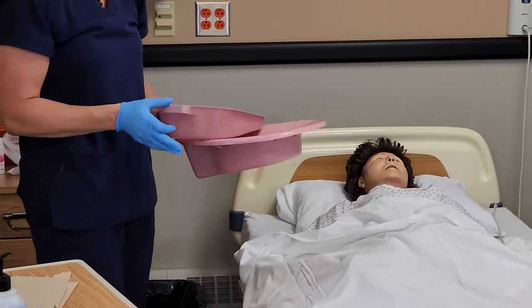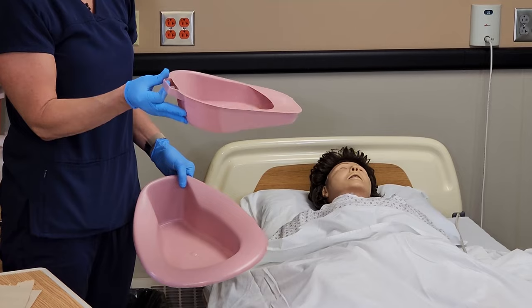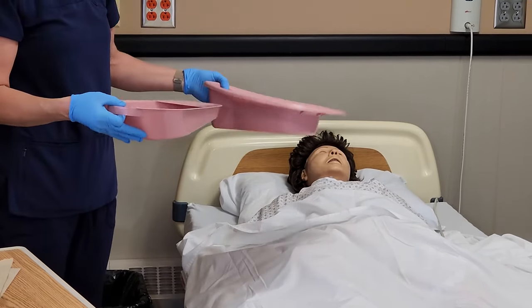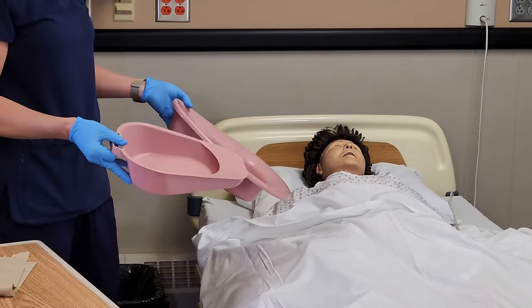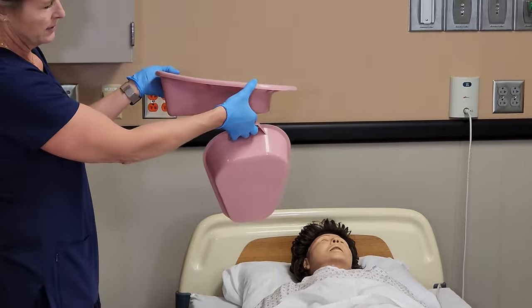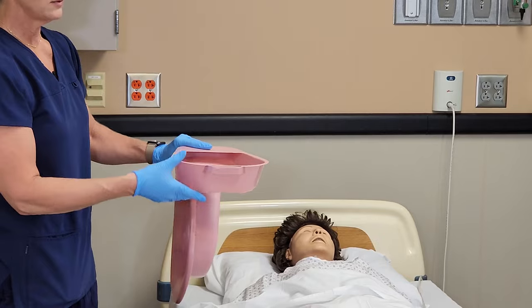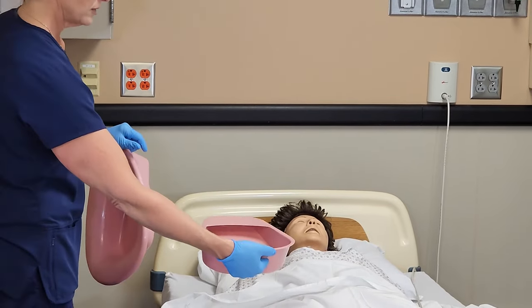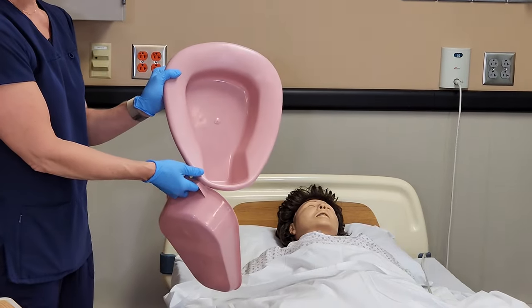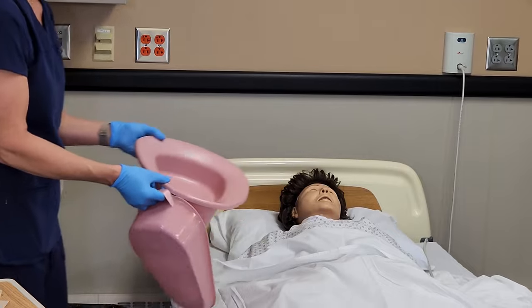We have both types here. A fracture pan is typically for people who have had a hip or leg fracture — it's a little bit smaller than a standard bedpan. With either bedpan, the lower end or the part that's not as wide goes underneath. The fracture pan is easy to remember because the handle is here. The normal bedpan looks like a toilet seat, and you'll just place them on like you would a normal toilet seat.